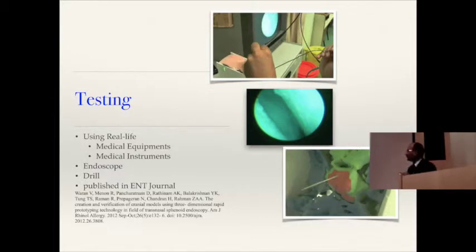It looks real. The feedback we got is that the surgeons say it really looks like a real patient they have operated on, and we've published that feedback in another paper. This is a picture of the tumor and the equipment they used to take it out, and they were quite happy with the results they obtained.